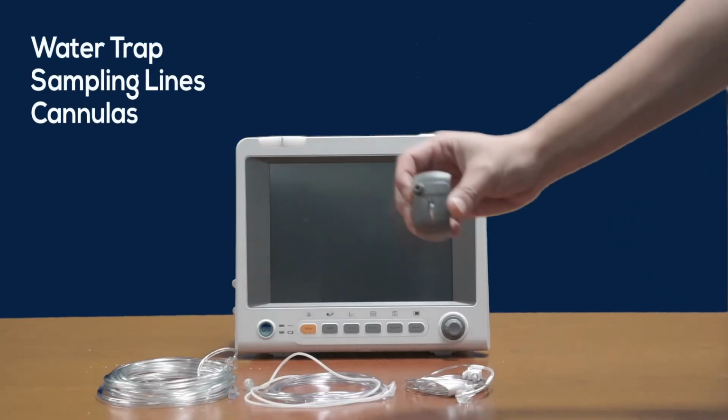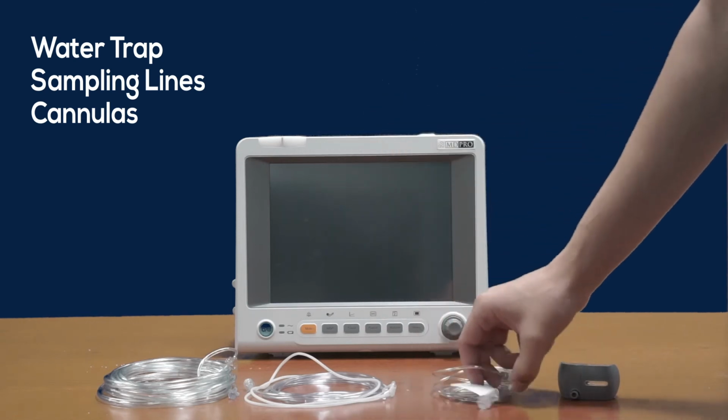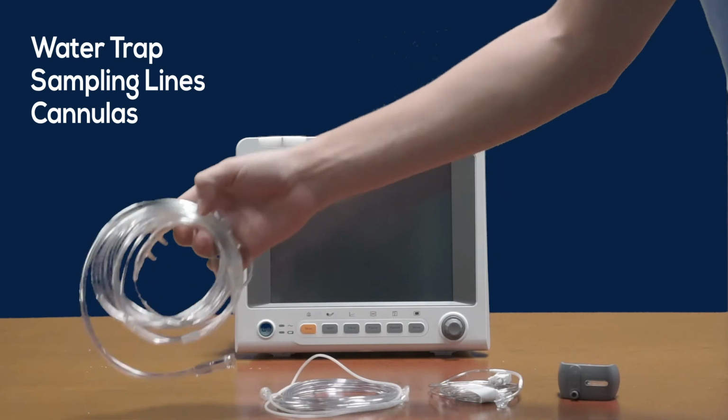Some standard accessories for CO2 disposables will include water traps, sampling lines, and cannulas. There are many different types of cannulas, everything from divided, pediatric, or adult.